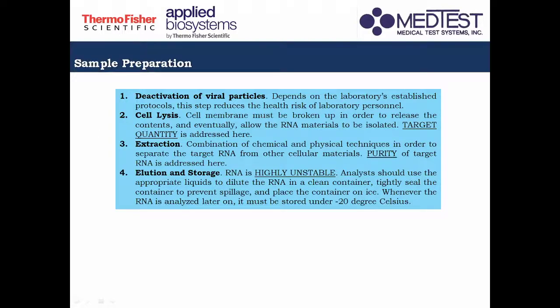Then the next is cell lysis. So part of the sample preparation is the cell lysis. So after we've collected our samples from a patient, we target to break up or disrupt the cells that we collected so that we will be able to get the target material.